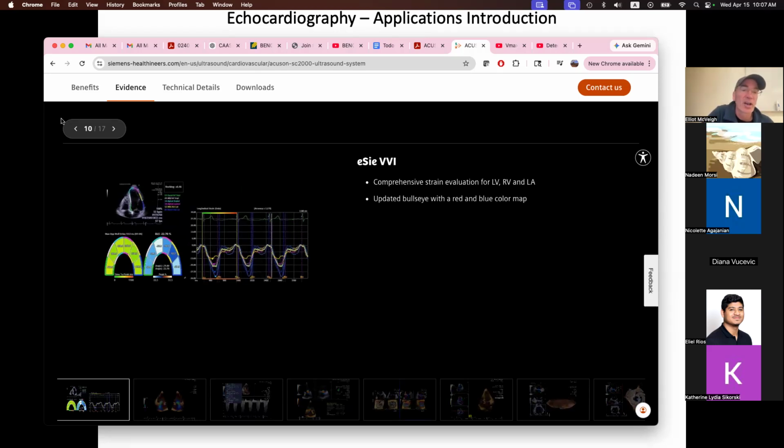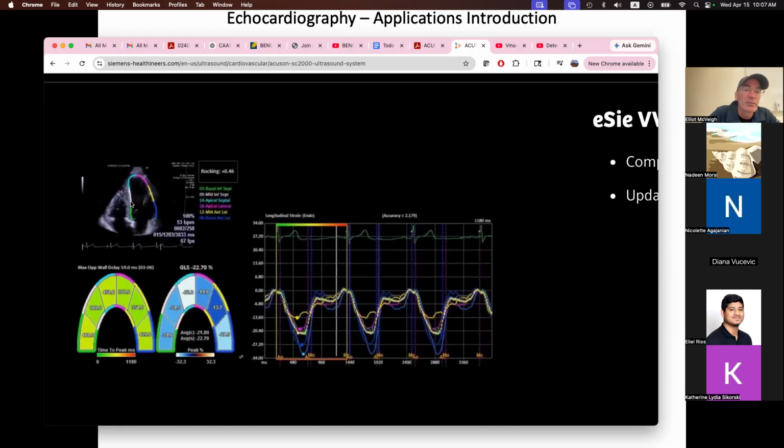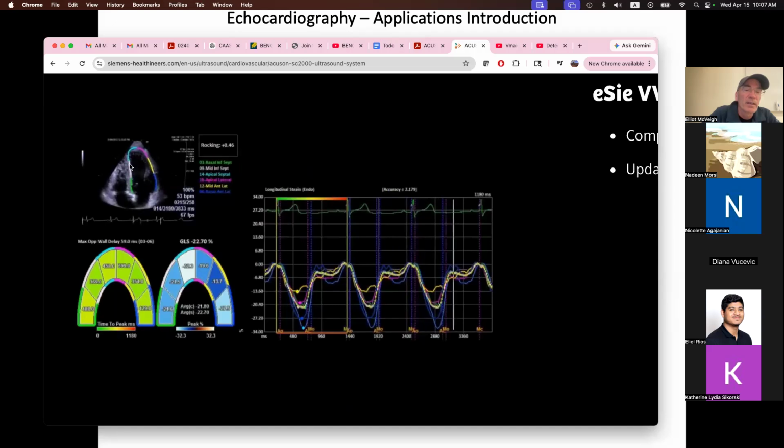Excuse me. These are segmental evaluation of how the muscle tissue is contracting. So this is tissue shortening, or muscle tissue shortening. Let me zoom this up a little bit here. And what we're going to measure is, say, the length of the yellow line and the length of the green line, etc. And we'll plot those lengths as a function of time.